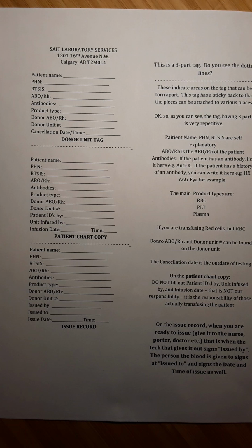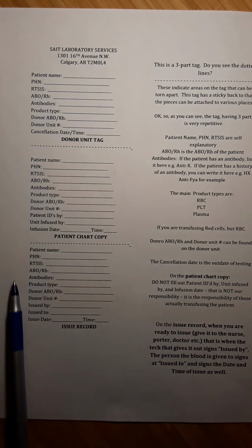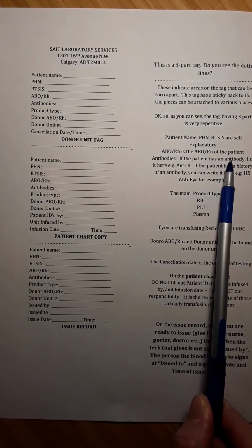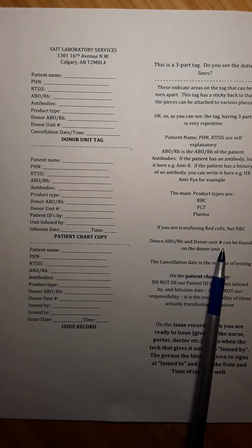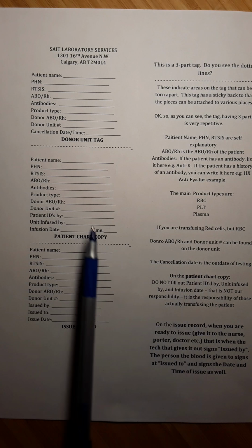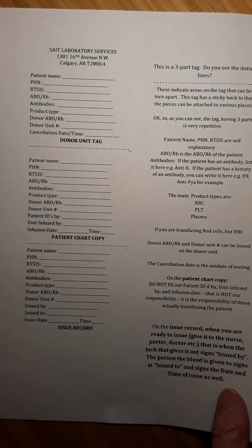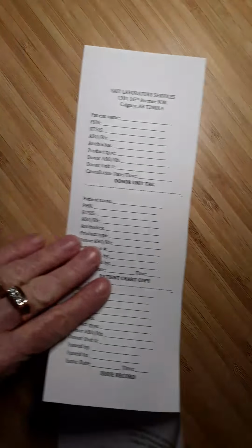So this document contains more than just the tag. The tag is depicted over here on the left-hand side of your page. On the right-hand side of the page, I've tried to put a description of the various pieces of information that need to get filled in on this tag. So I'm going to work for this video on the tag itself, and we'll run through the tag and see how to fill it out.